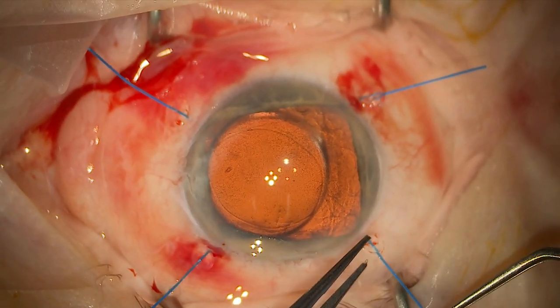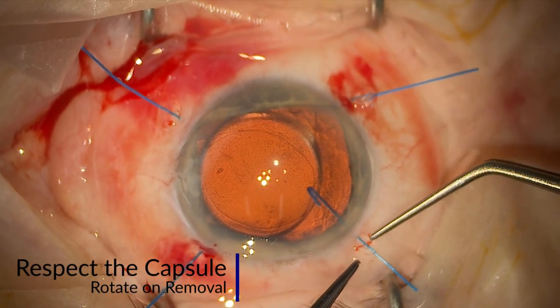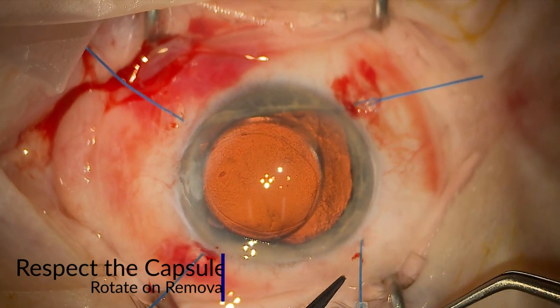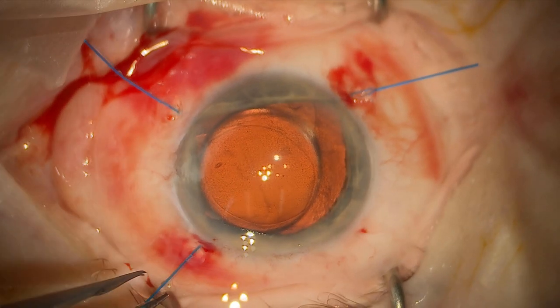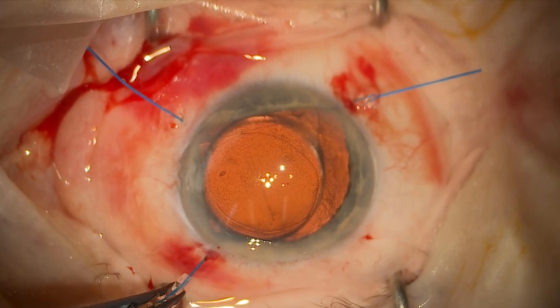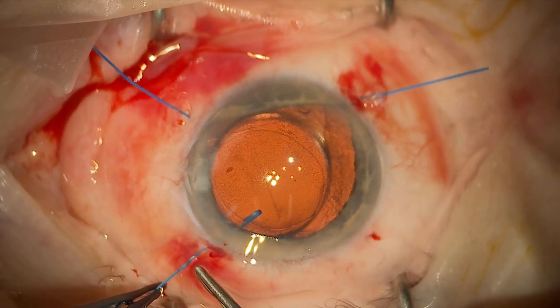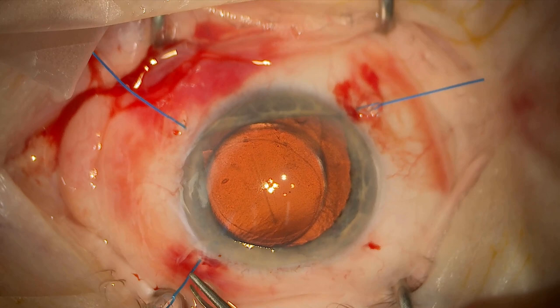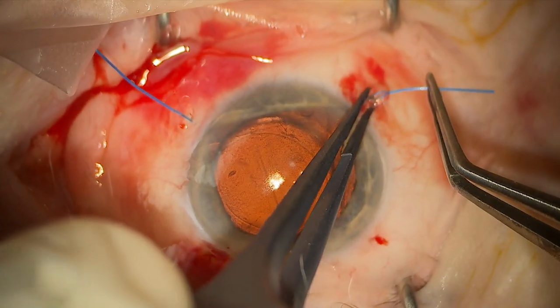Removal of the iris hooks can be quite a dangerous process as well and you really need to respect the capsule. Gently loosen the iris hook, rotate it, and make sure it's away from the capsule when you pull it away. You don't want to pull or rip the capsule and cause an anterior capsule tear when you're removing the iris hook. The iris hooks are quite flexible and you can rotate them when you take them out, but given they're quite flexible you can also just pull them out as long as they're rotated upwards.